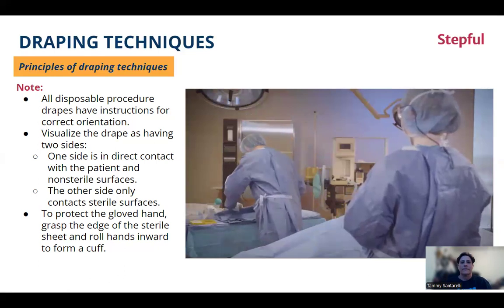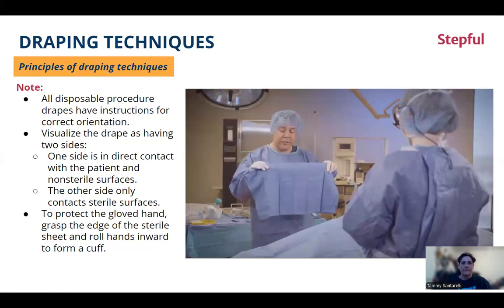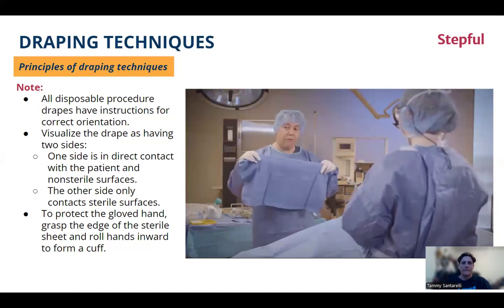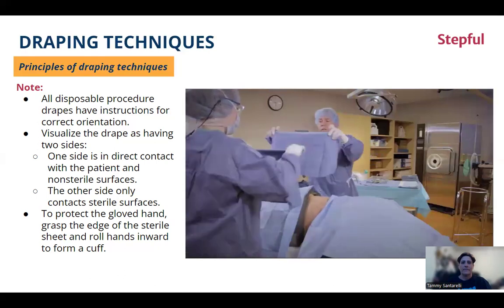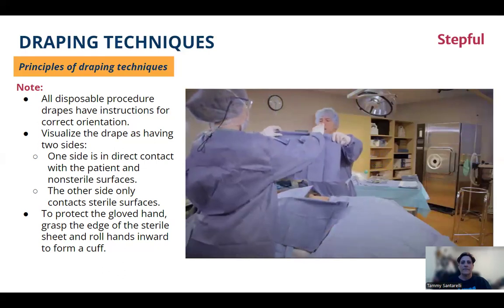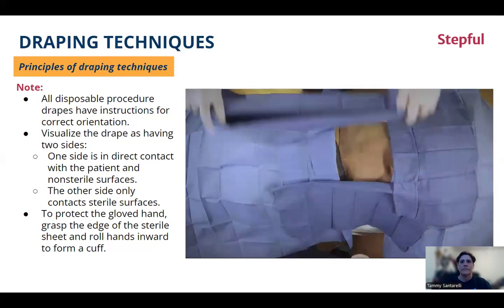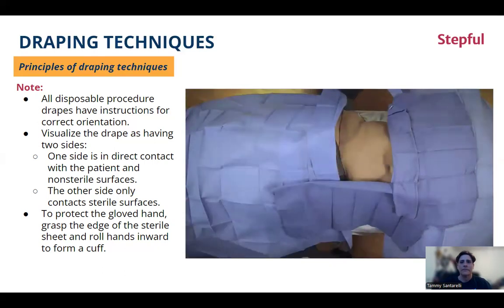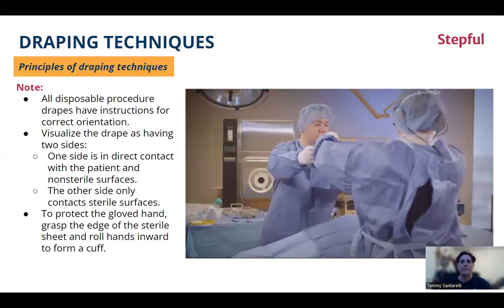Next are the towels. We want to make sure that we've already prepared the towels ahead of time. We bring all four up at the same time. So my surgeon's going to grab the first towel and place it on their side. Next, we're going to go superiorly, or the top side. Inferiorly, or the bottom side. And then the last side is my side.